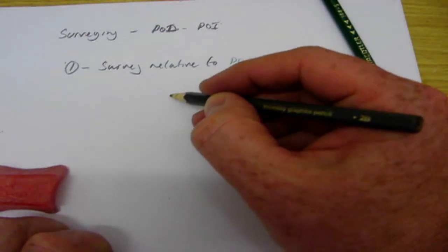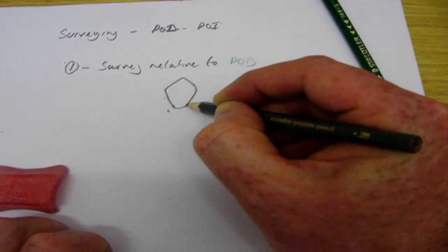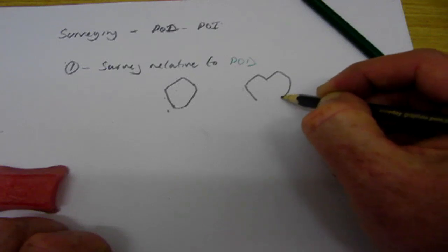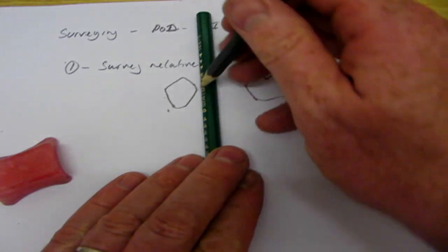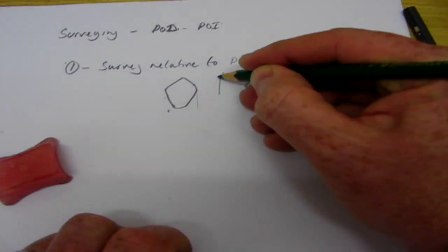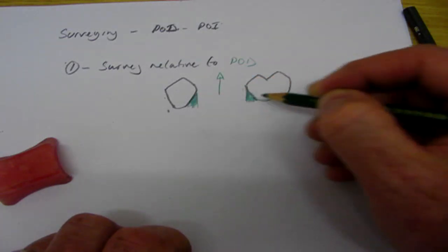On our model just there, we had the situation where we had the premolar like so, and the molar here, and when we survey this, put our surveyor arm down the side, we see that there's undercut relative to the path of displacement. Remember, the path of displacement is always at right angles to the occlusal plane, and we can utilise this undercut, or we can just simply block both out.